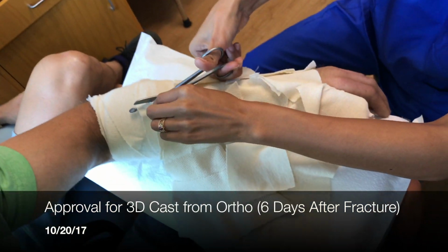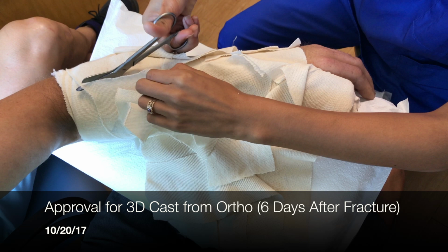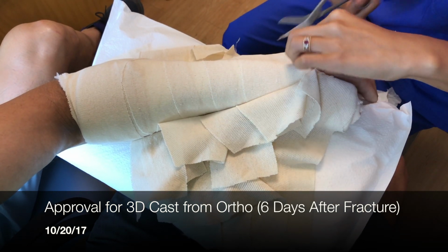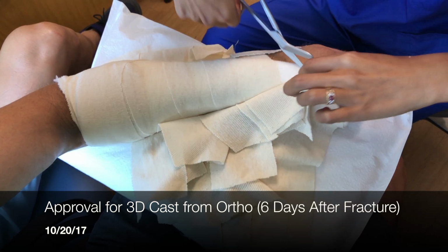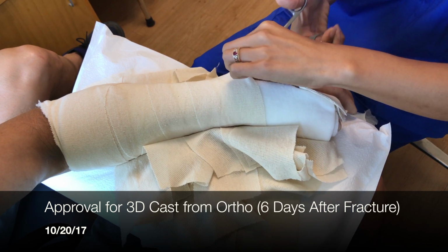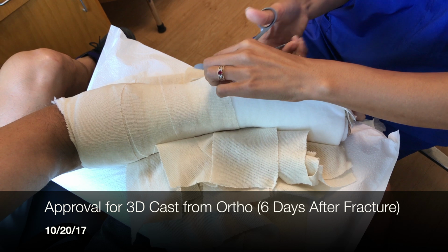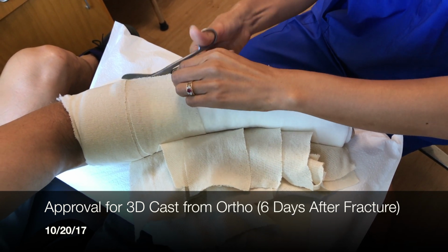Okay, so we are now 6 days after the fracture. I have been put in the splint that you see them cutting me out of, that was placed on me the preceding Saturday at the emergency room. You're going to see, actually at the end of this little section here, how dirty my hand was. They kind of neglected to clean off my arm completely.